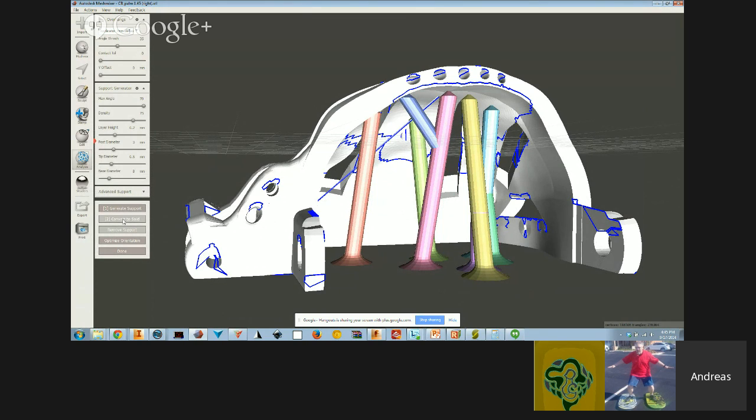The convert to solid will... Is it going to do it? Okay, I'm in some strange state. My install might be a little funny. Let me go back. Generate support. Here, I'll just reduce this and do some more. Generate support. It might be that I have to do it linearly. I think we might have to remove and then regenerate. Let's remove. All right, stand by.